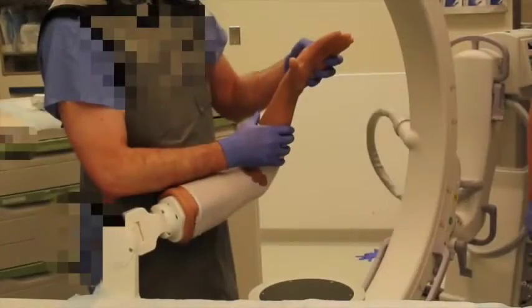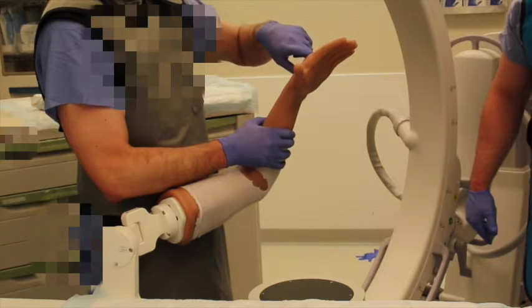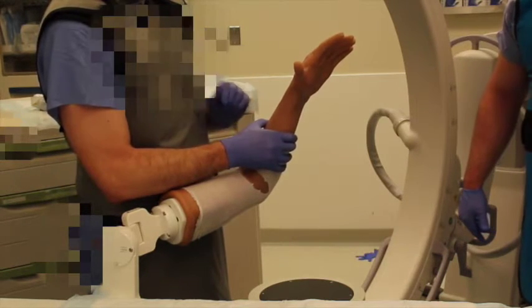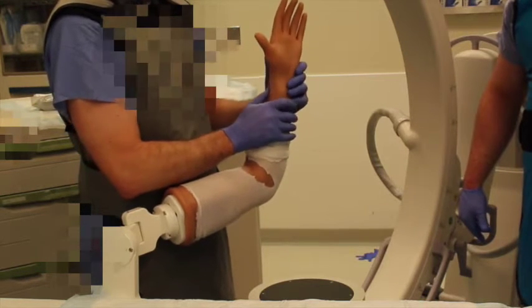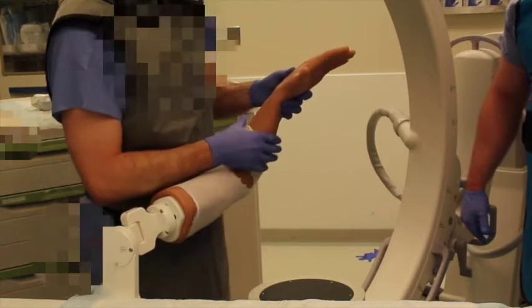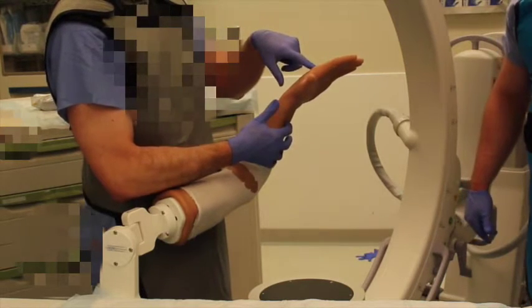With the fracture reduced, gentle pressure on the dorsal aspect of the hand will hold the fracture reduced. However, any release of this pressure will allow some internal mechanisms to cause the fracture to re-displace. Very little force is required to hold the fracture in reduced position because of the intact periosteal hinge.